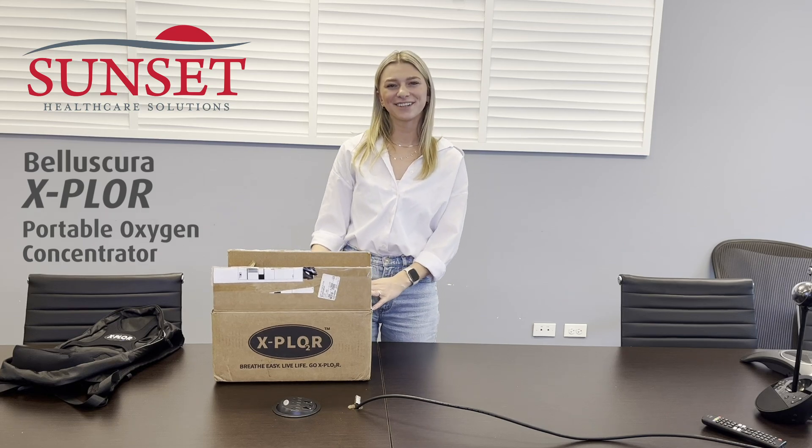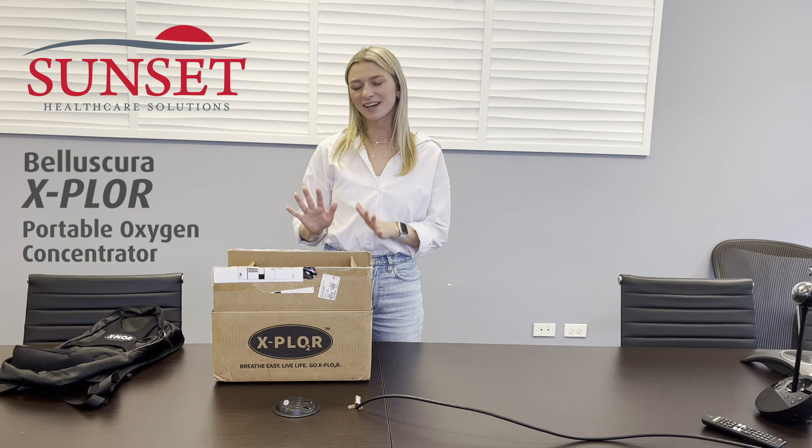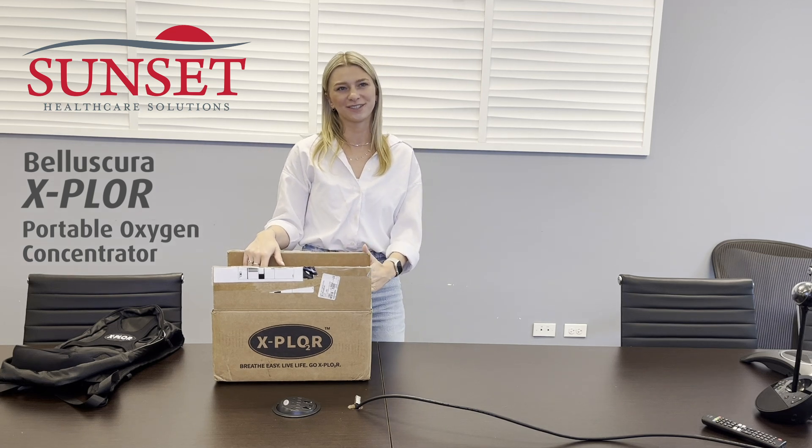Hi, my name is Michelle. I'm a Lead Sales Rep here at Sunset Healthcare Solutions. I wanted to do a quick guide and unboxing video of the Explorer Portable Oxygen Concentrator.